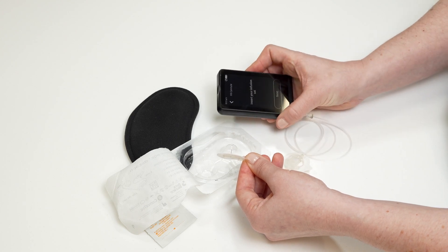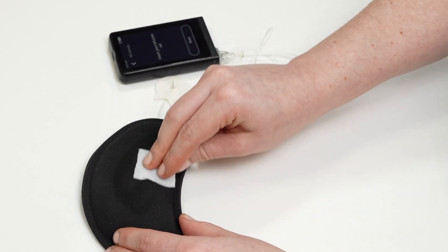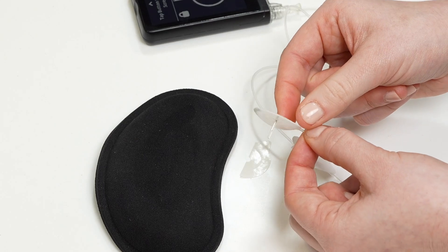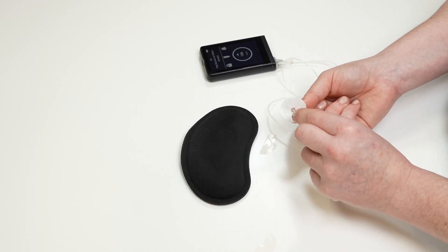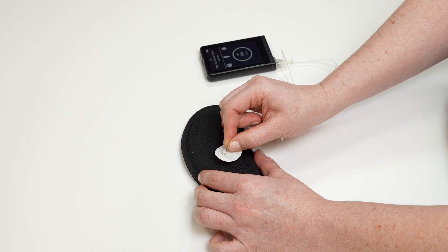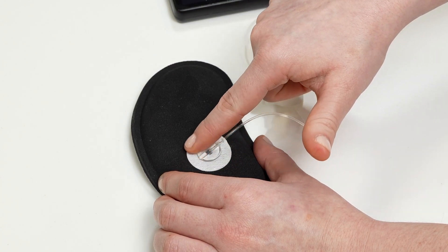Tap yes to confirm that you need to insert your infusion set. To insert your infusion set, first clean the site on your body with an alcohol swab. Remove the adhesive backing from the infusion set. Pinch the plastic circle on the back of the infusion set to make a small handle. Gently twist the needle guard off the needle. Pinch the skin and insert the infusion set at a 90 degree angle. Push gently on the center of the circle and rub the adhesive around the circle to help secure the infusion set.